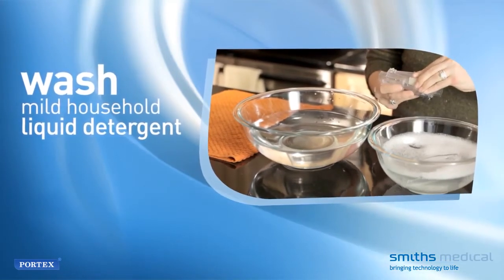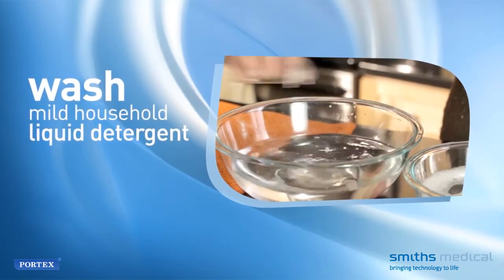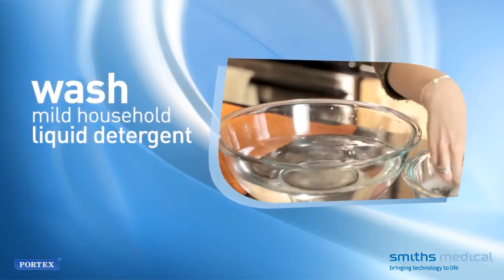Carefully wash each part with a mild household liquid detergent to remove all secretions. Next, to disinfect, there are four recommended methods.